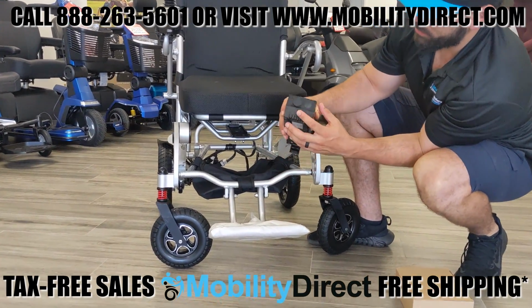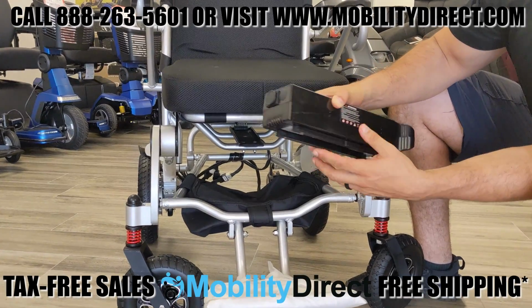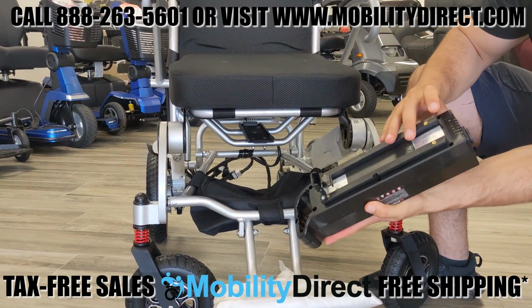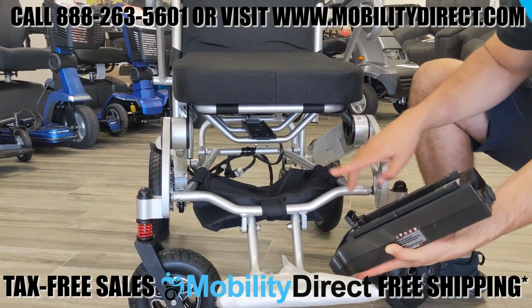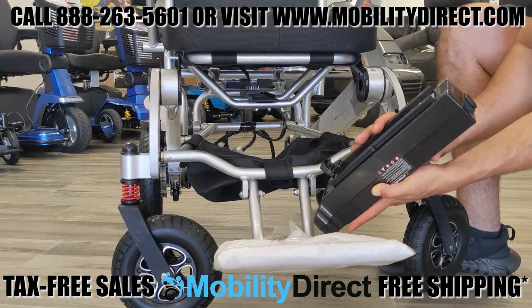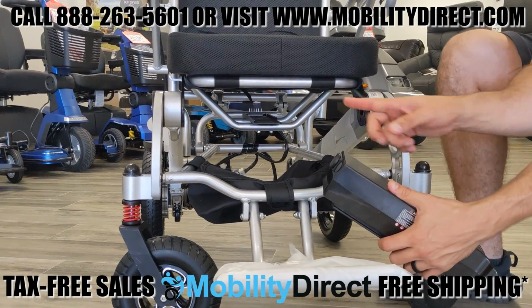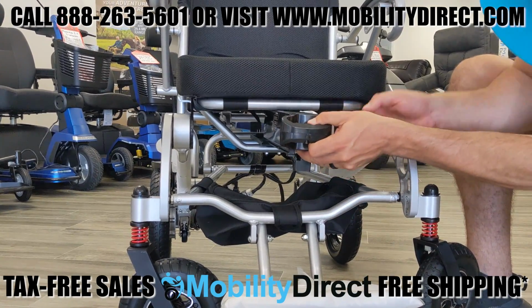and you can charge the battery both on board while it's physically installed into the chair or off board when it's not. As you can see, there's a little lid for the charging port. There's a terminal connector on the back side and 2 sliding rails that you're going to use to push that battery back into that sliding adapter. The terminal goes right towards the back. So make sure that the charging port and terminals are facing forward when you slide it into place there.